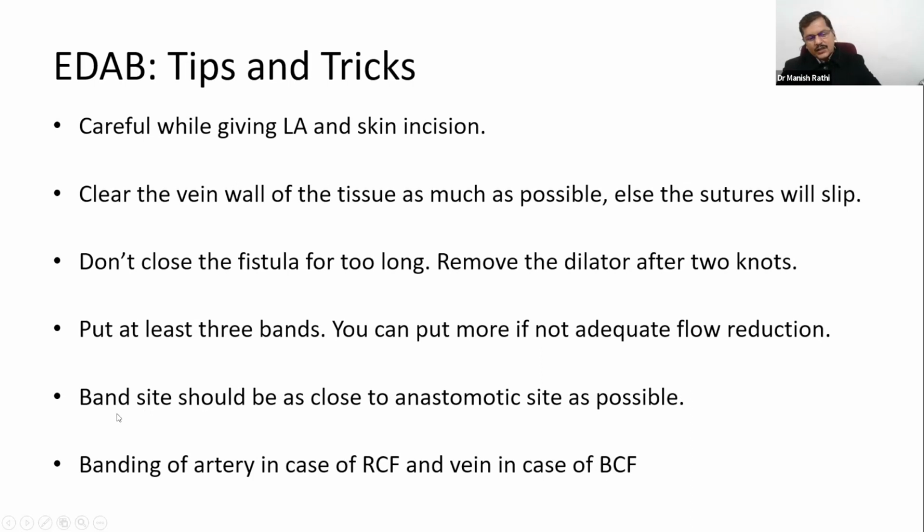And another important thing is this banding should be as close to your anastomotic site as possible, because what will happen is if you do it more distally, your proximal segment will get dilated and aneurysmal, because the fistula flow is still high till your stenosis. So you don't want that. So it is good to do the banding as close to anastomosis as possible, so that there is no dilated segment in between.